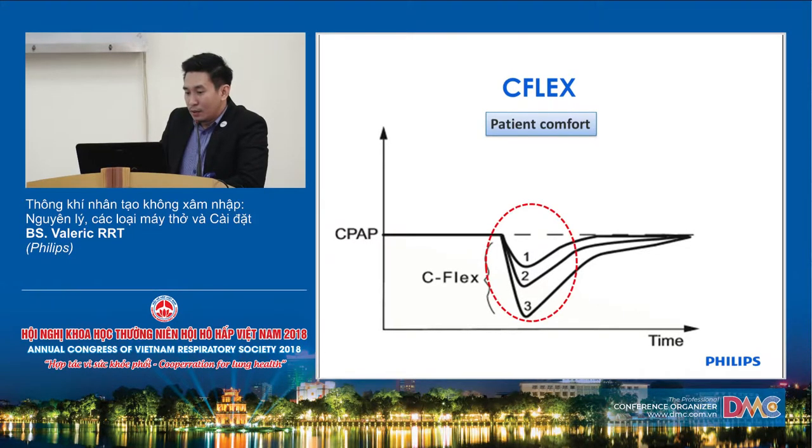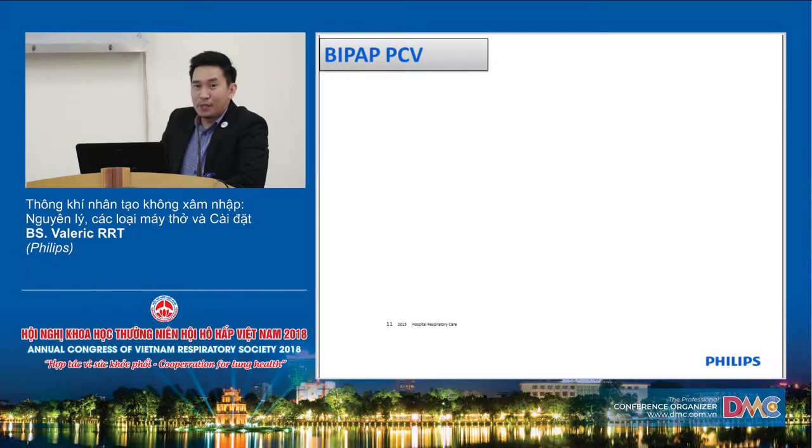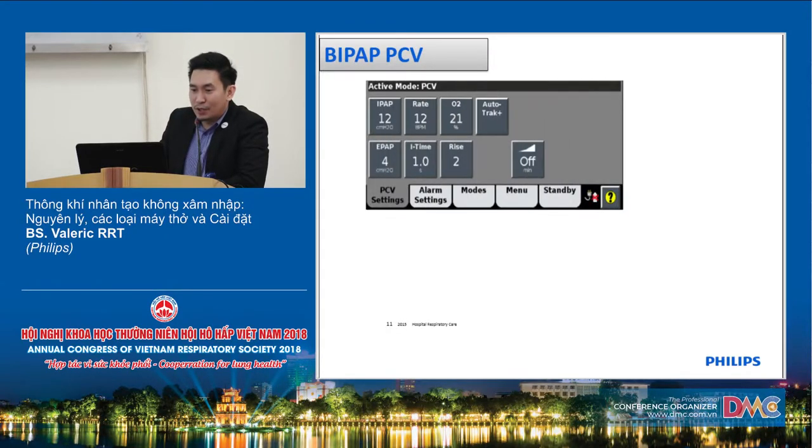Okay, so our next is BiPAP PCV. Are you using BiPAP? I assume BiPAP. Yes, okay, so let's start with the BiPAP PCV. Like what I said earlier, we have the basic settings. The basic settings for the BiPAP are the IPAP and the EPAP.